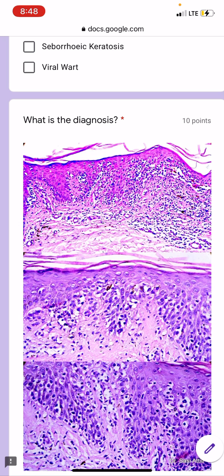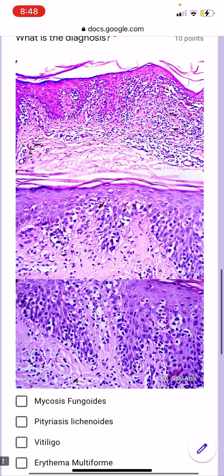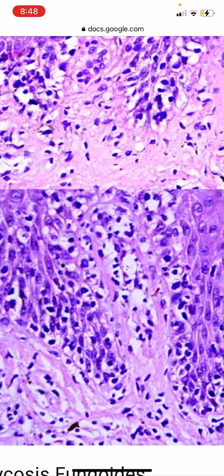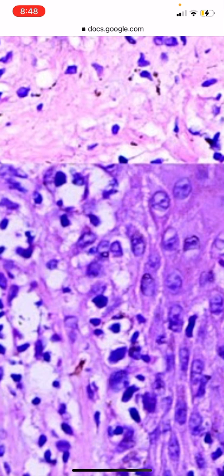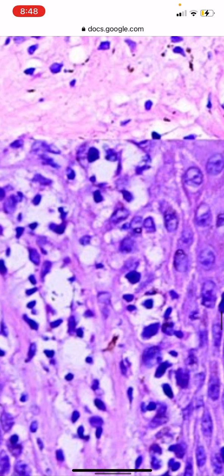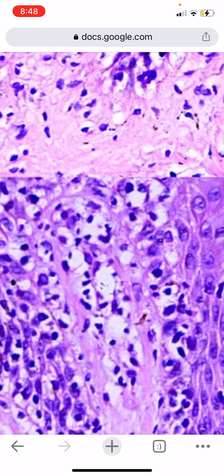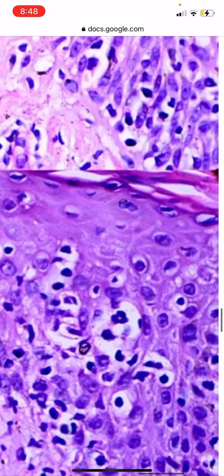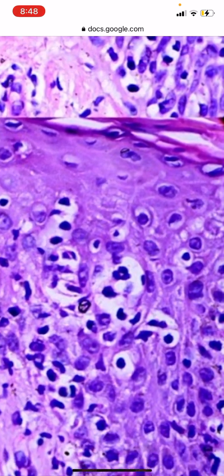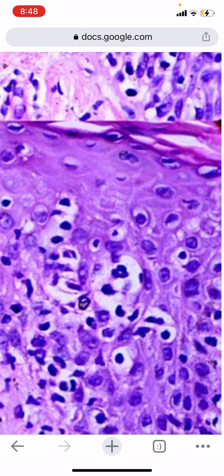The fourth diagnosis is in fact a typical histological picture. You cannot get any more typical than this. These are lymphocytes that are lining up along the basal layer with a perinuclear halo. The lymphocytes here are slightly atypical. Look at this shape. The shape is irregular, with much larger nuclei here. They're not all of a uniform shape. Some of them are big, some are small, not all of them are round. All of them have a perinuclear halo. There is not much spongiosis, and in fact, this is a Pautrier's microabscess that you can see in the middle of the screen, where you see a confluence of atypical lymphocytes forming almost a microvesicle.